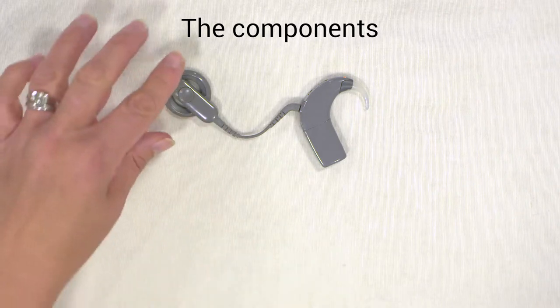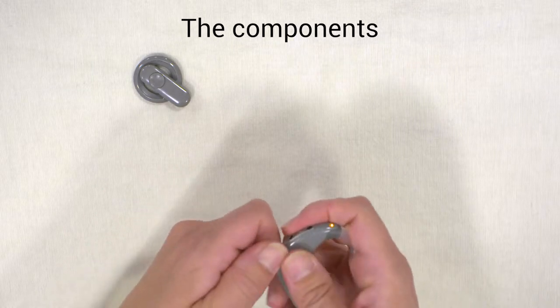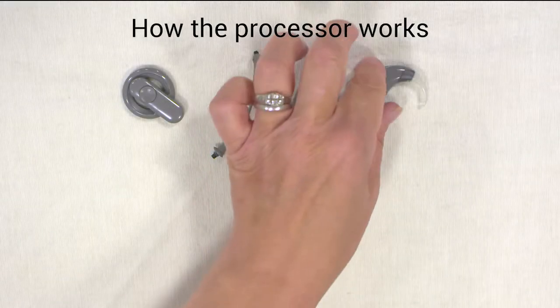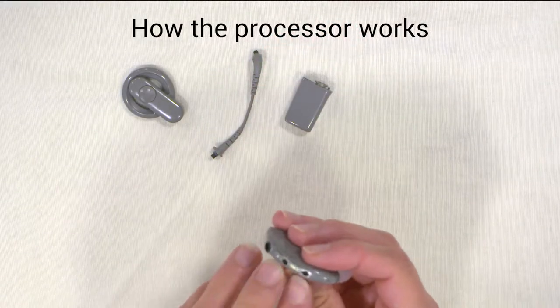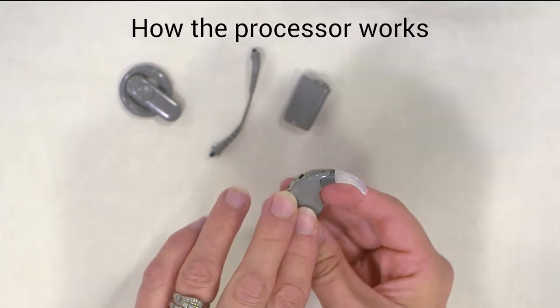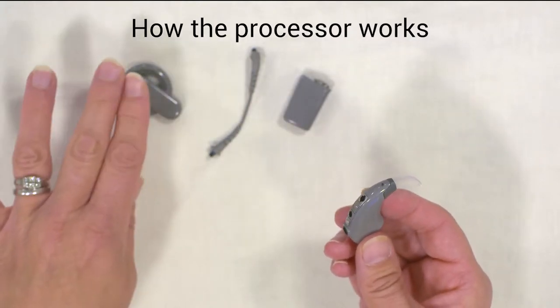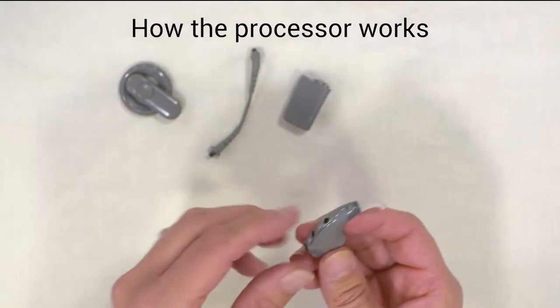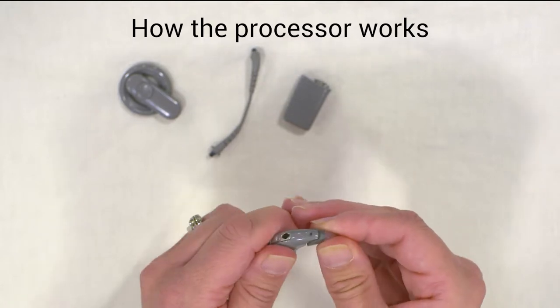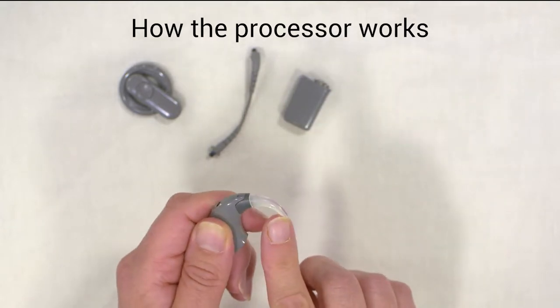I'm going to take the pieces apart first. Starting with the processor — the processor has microphones that pick up the sound. The sound is then converted into an electrical signal and passed on via the coil into the implant. It has an earhook which simply clicks off and clicks back on. The earhooks come in different sizes.